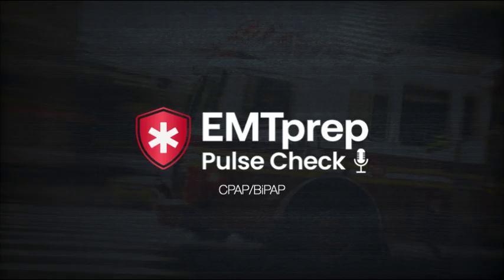EPAP is essentially PEEP. And CPAP is different than PEEP because CPAP will deliver the continuous positive airway pressure, whereas PEEP just provides positive pressure at the end of exhalation. However, CPAP works fairly similar to it due to providing that pressure the patient has to breathe against.